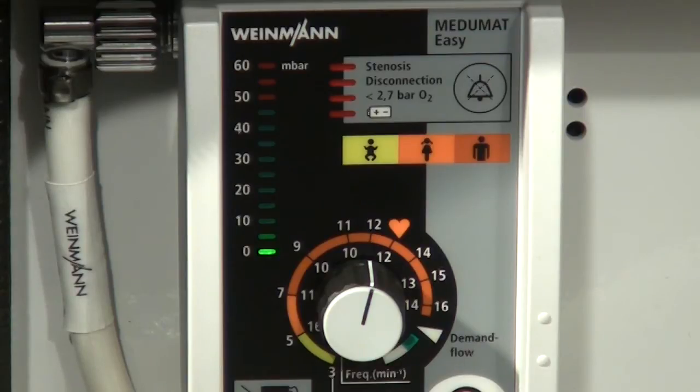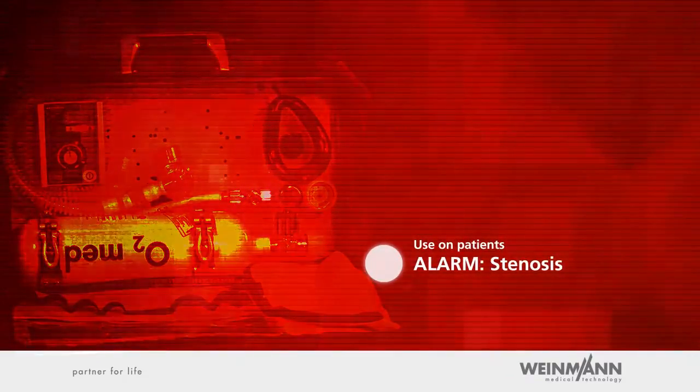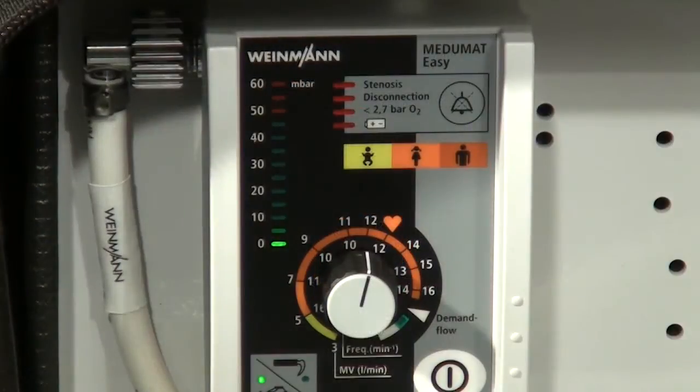The current ventilation pressure can be read on the ventilation pressure gauge at any time. When the device is switched on, the maximum airway pressure is set to mask ventilation, meaning pressure will increase to a maximum of 20 millibar. Alarm — Stenosis: if airway pressure exceeds 20 millibar, the stenosis alarm is emitted. At the same time, a safety valve opens and Mejumat Easy interrupts ventilation. The voice prompt additionally indicates the most common reasons for exceeding the maximum airway pressure. After the cause of the alarm — for example a foreign body in the airways — has been eliminated, ventilation of the patient may be continued.